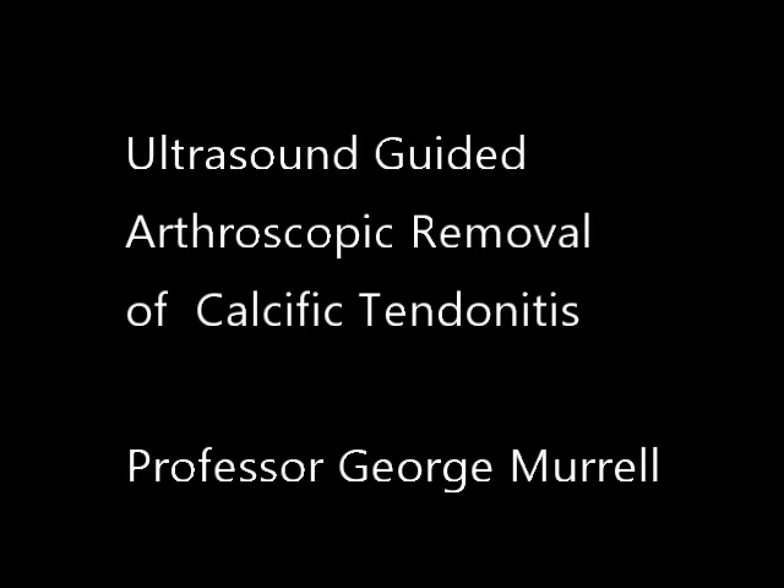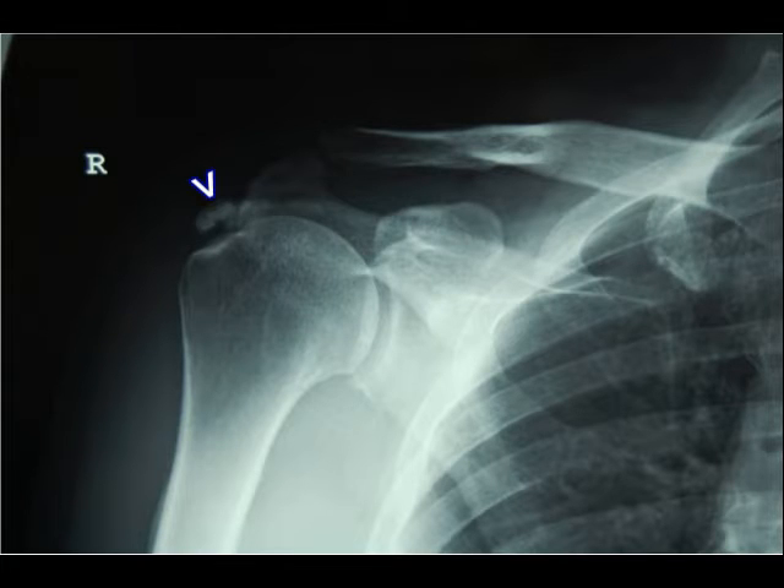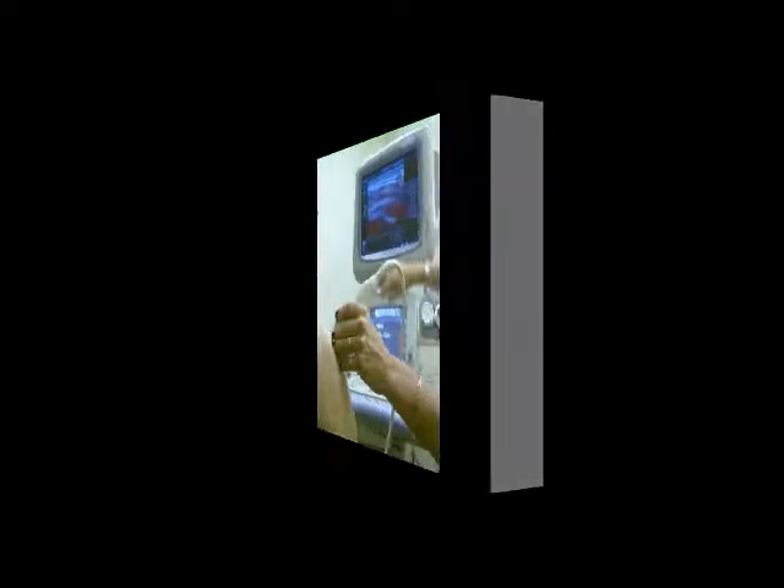Ultrasound guided arthroscopic removal of calcific tendinitis. Here we can see some calcific material in the supraspinatus.